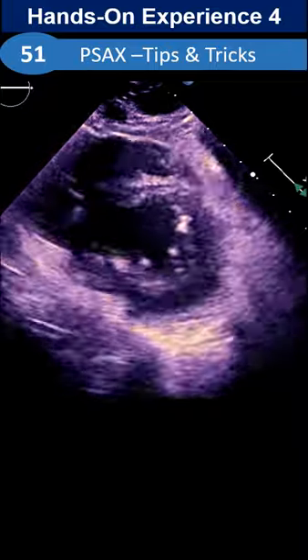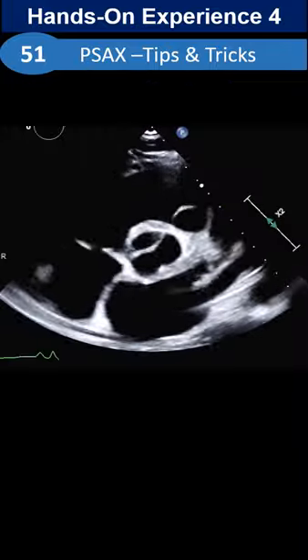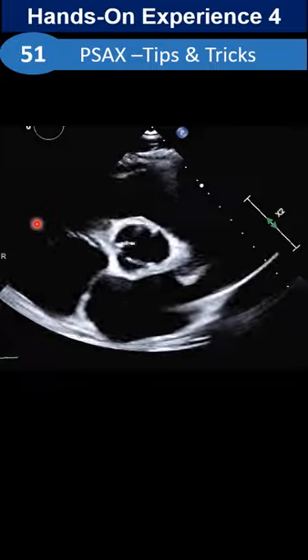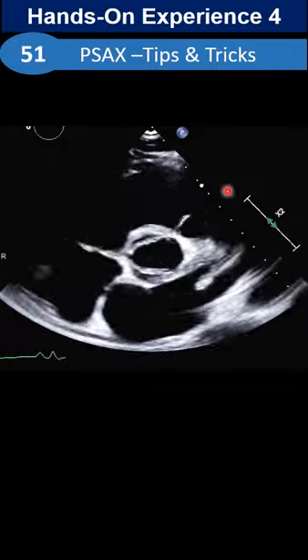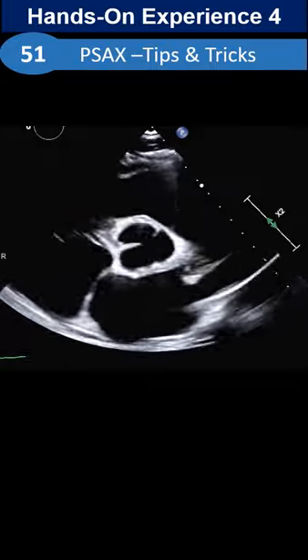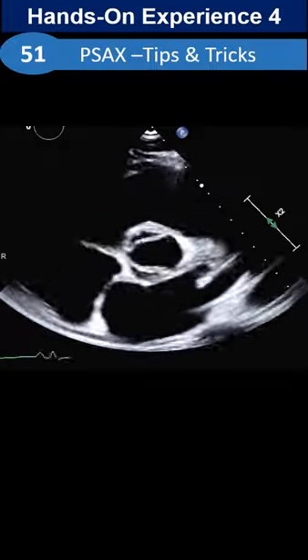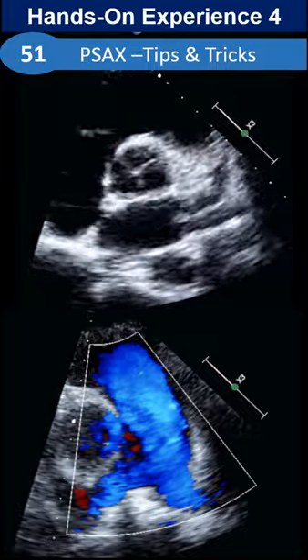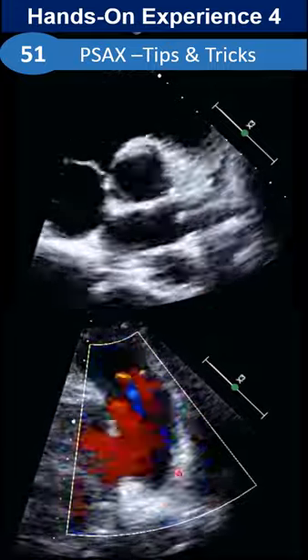If the PSAX is correct, how can we fix it and show the tricuspid and pulmonary artery completely? What maneuver has been done for this?